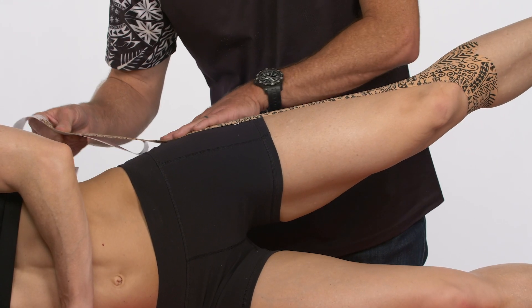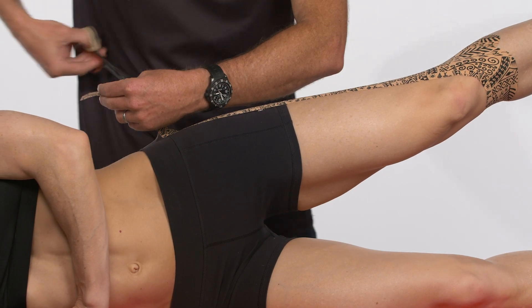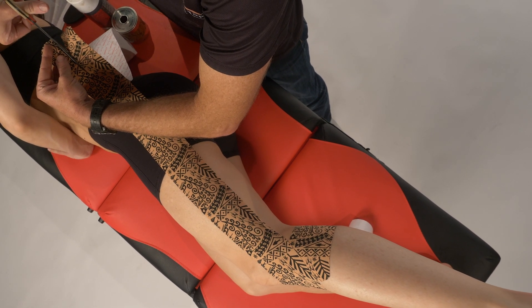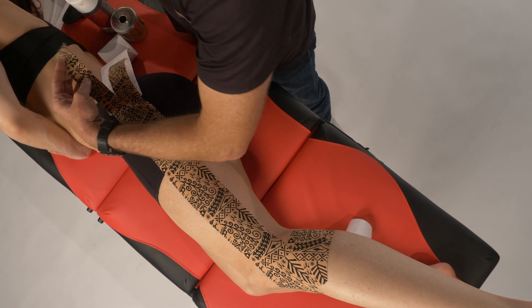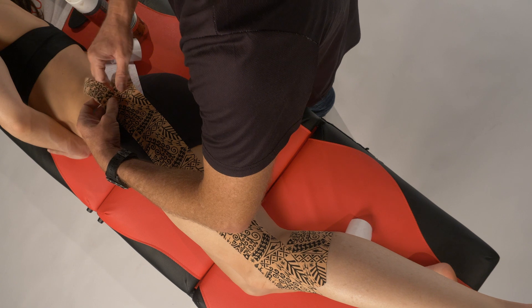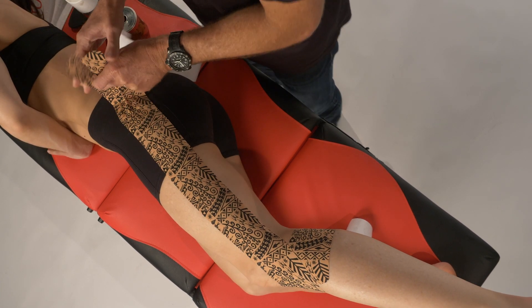The other option, once we get to the trochanter — a little bit superior to it — is to actually split the tape through the middle. That gives us two bands to work with, because the iliotibial band has contributions from the tensor fasciae latae anteriorly and then the glutes posteriorly.